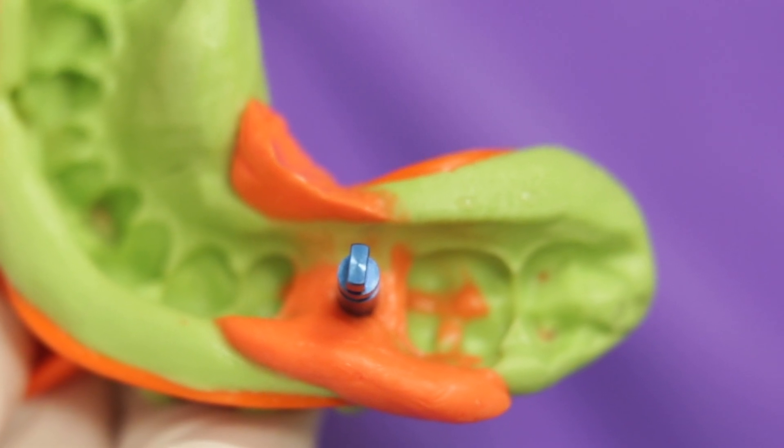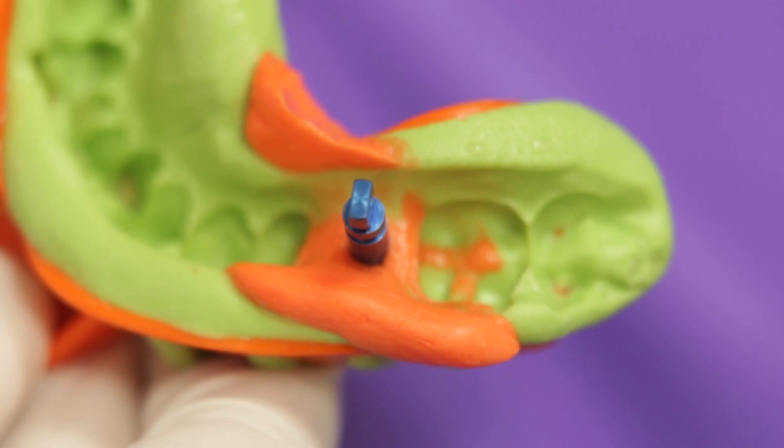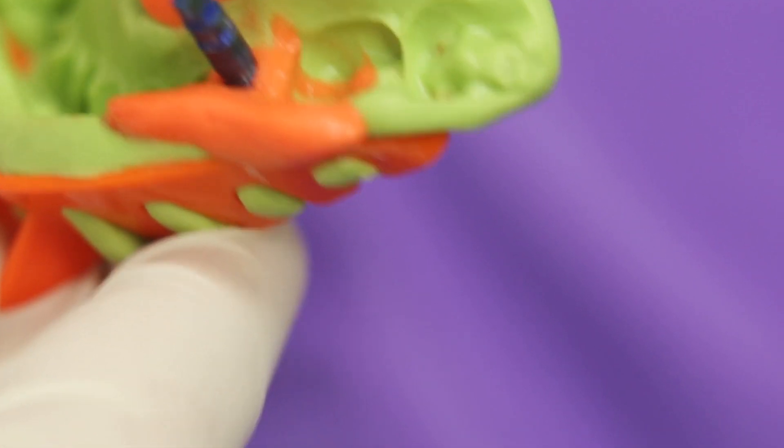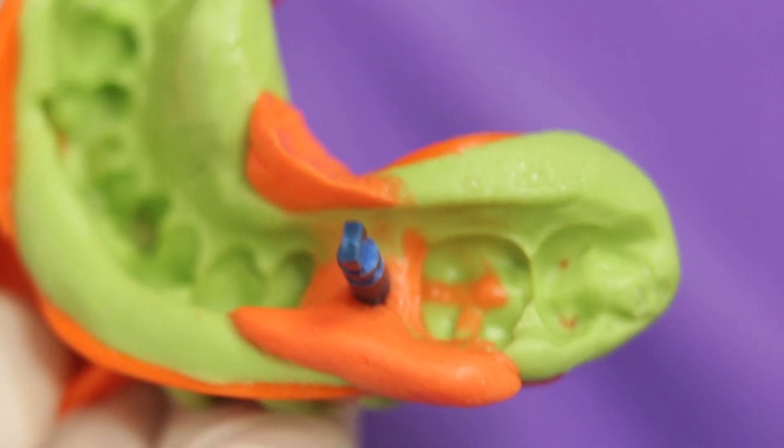These open tray impressions are considered more accurate, especially when there are multiple and non-parallel implants. Because they are picked up along with the impression, it reduces the chances of distortion drastically.